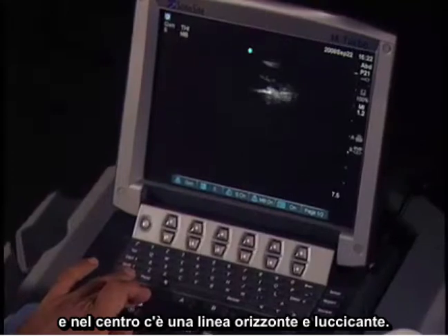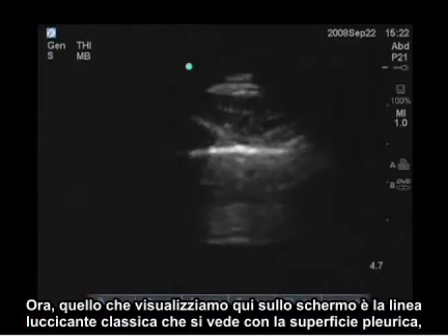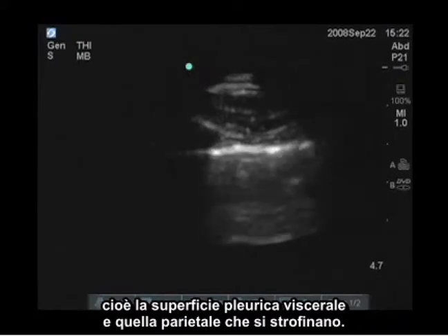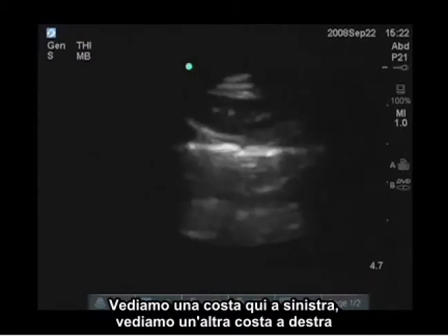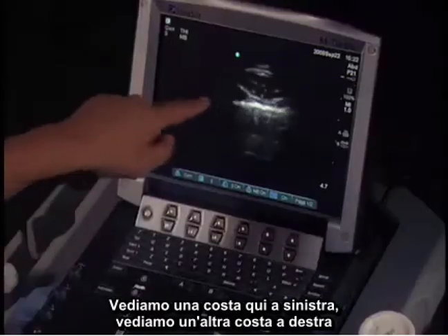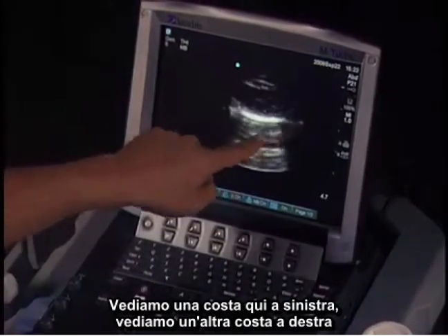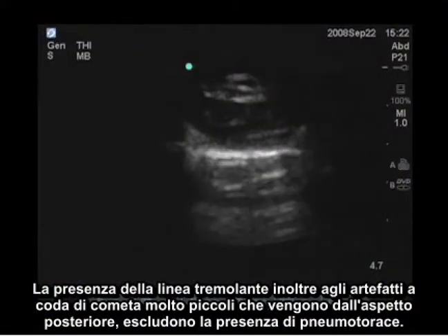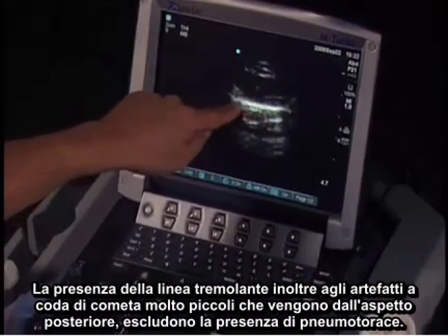What we're looking at on the screen is the classic shimmering line that you see with the pleural surface — that being the parietal and the visceral pleural surface rubbing against each other. We see a rib on the left and another rib to the right. In the center is a horizontal line where we see shimmering. The presence of that shimmering as well as very small tiny comet tails coming from the posterior aspect of that line excludes the presence of a pneumothorax.